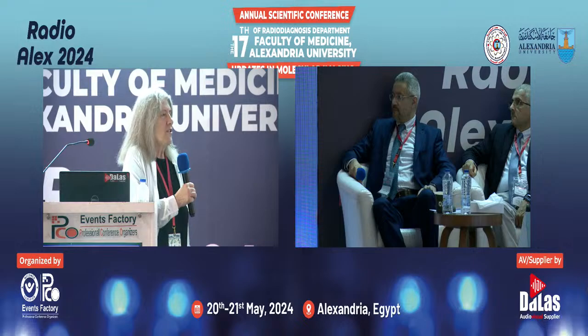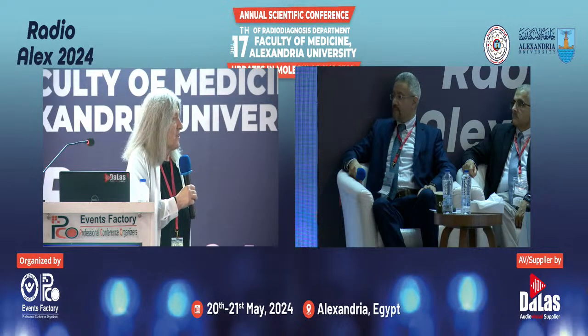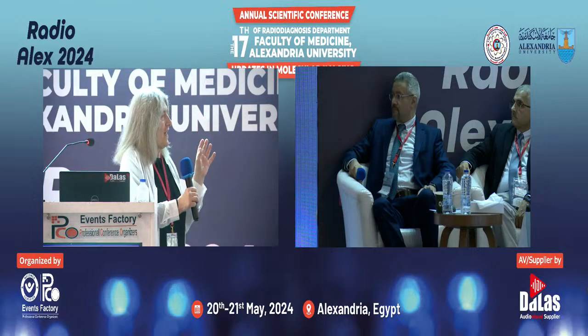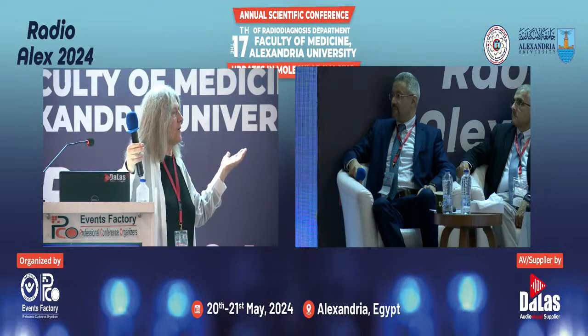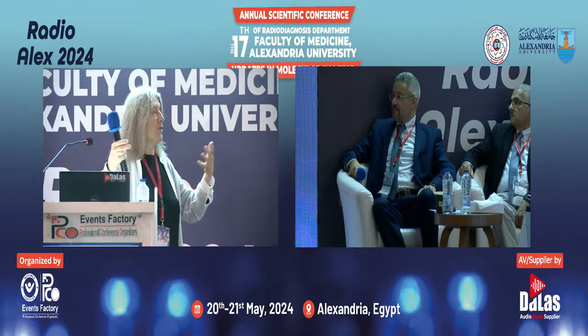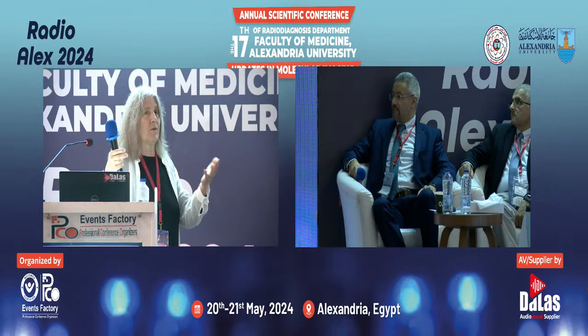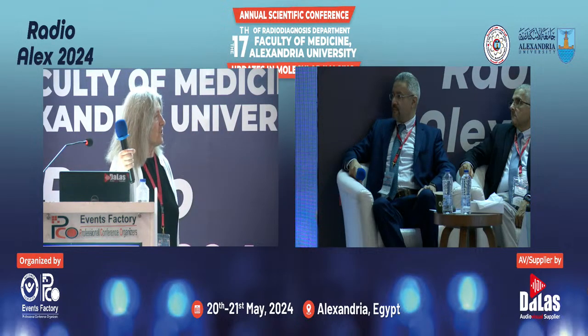There are certainly some advantages of MRI. For example, prostate. If you did a combined PET CT, or combined PET MR with prostate, that would be fine. In the brain, for example. But the problem with the brain is the brain doesn't move, and you can fuse the MRI to a PET scan. These are both DICOM images, and you can do a fusion after you've acquired them separately. You can view a PET with an MRI of the brain because it doesn't change its position with breathing. It stays the same.